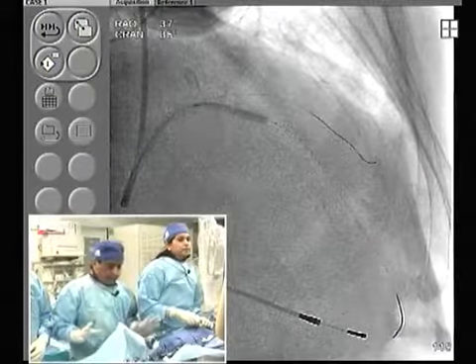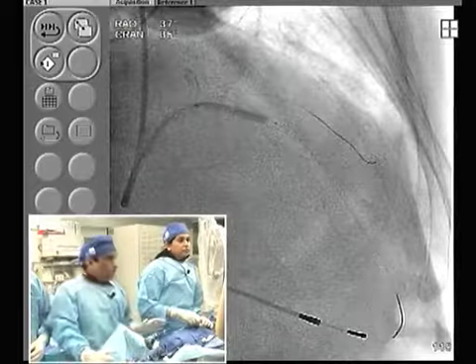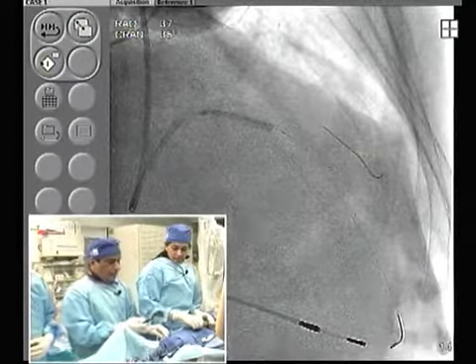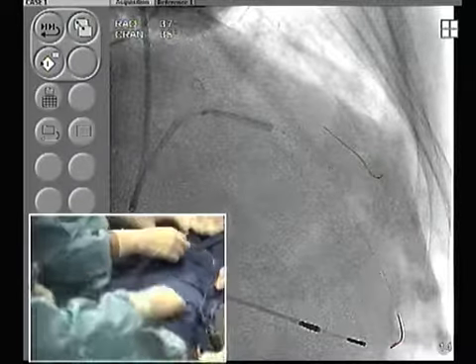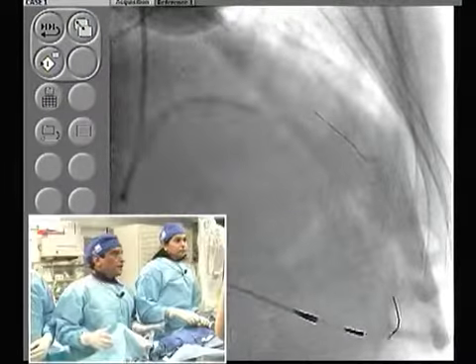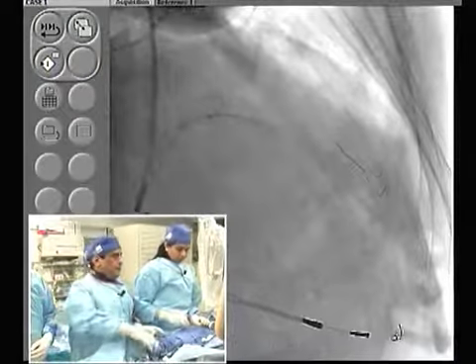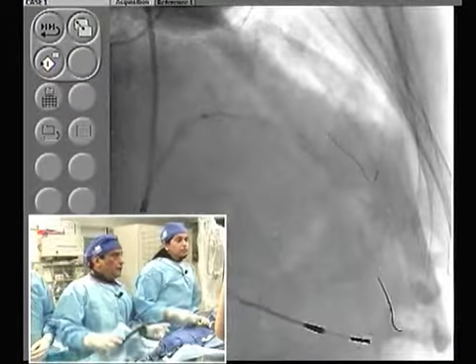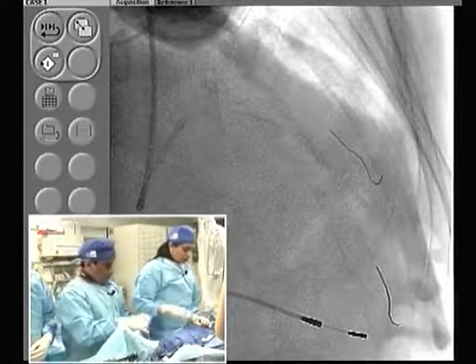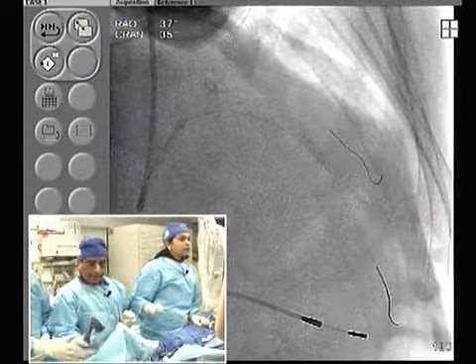One second. The long stents take a lot of time to deflate, and many people use a higher dilution of the contrast in these long stents for rapid deflation. We have a 7 French Mach 1 VL 3.5 guide.